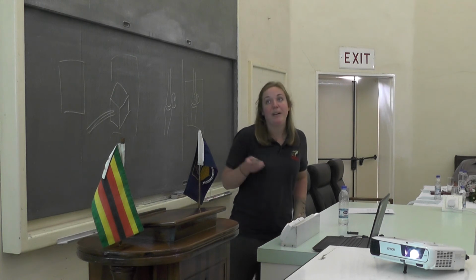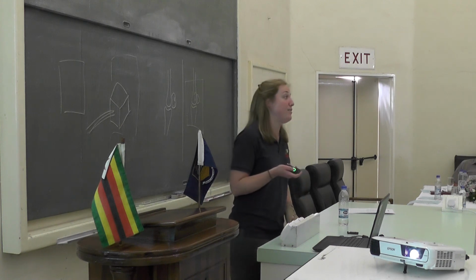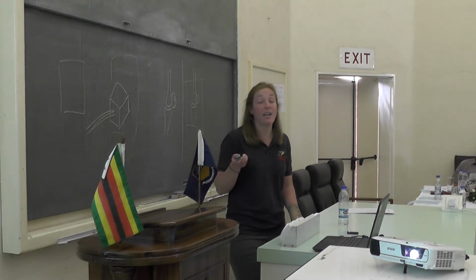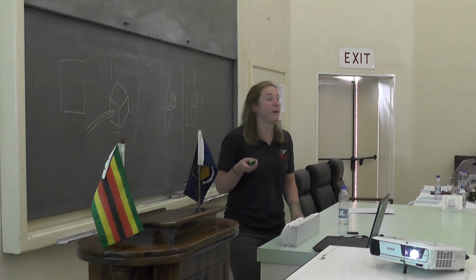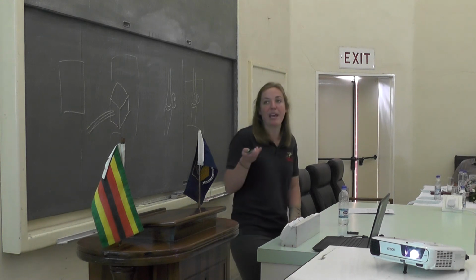So just to wrap it up, know the concepts and know what you're trying to achieve. That is the main thing. And then you can be creative and adjust to whichever animal you're presented with. Then just remember a few other things for completion. Labeling: you might forget the following month whether you x-rayed the left or the right leg. The position of your labels on the cassette might help you identify the lateral and medial side. Also exposure, collimation, and keeping everyone very still. And that's it. Thank you very much for listening.